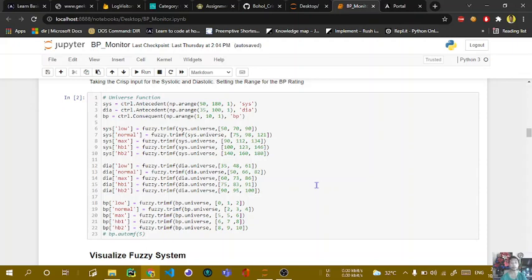In systolic, we have low 50 to 90, normal 75 to 121, max 90 to 134, high blood 1 100 to 146, high blood 2 is 140 to 180. Low for diastolic is 35 to 48, normal is 50 to 82, max is 60 to 86, high blood 1 is 75 to 91, high blood 2 is 90 to 100. So the rating would be low, which is 0 to 2, normal 2 to 4, max is 5 to 6, high blood 1 is 6 to 8, high blood 2 is 8 to 10.